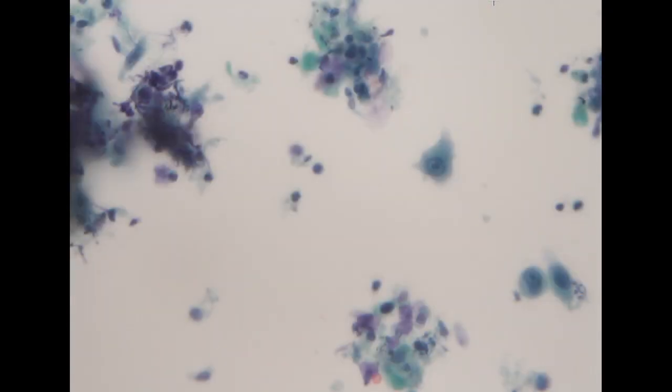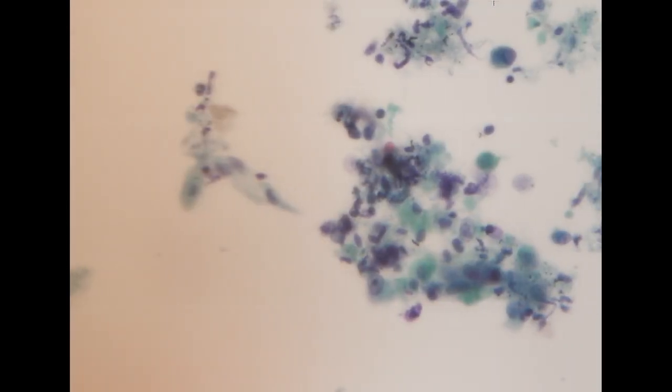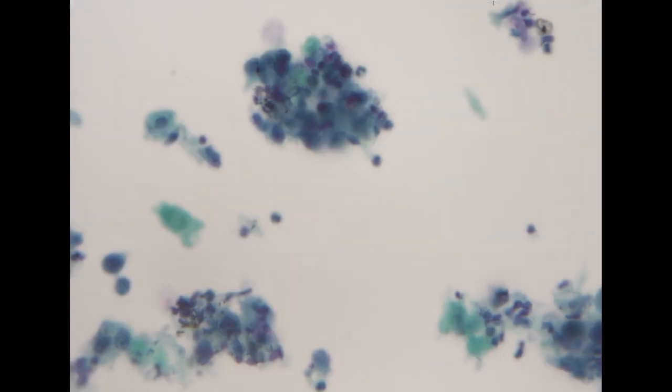So we will wait for the biopsy. But just based on the morphology, it's diagnostic for malignant, okay? And so we suspect the most poorly differentiated type of cancer in the pancreas, which is undifferentiated carcinoma, just based on the morphology.